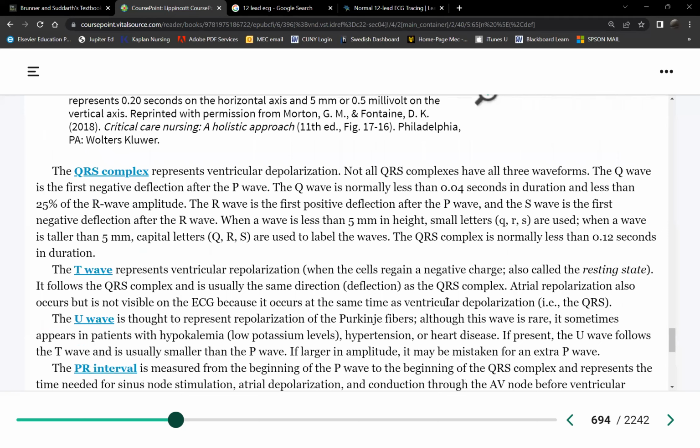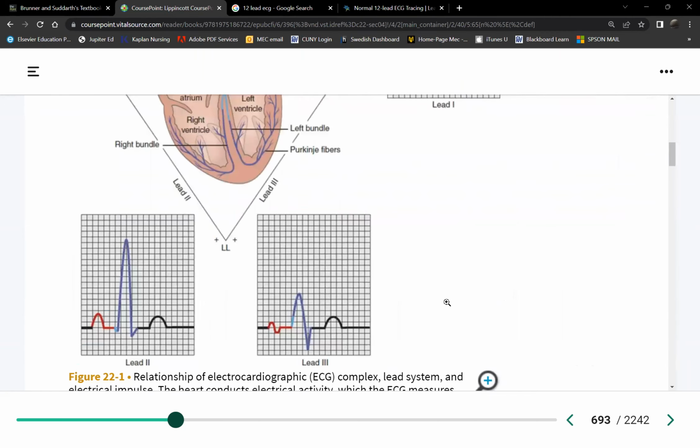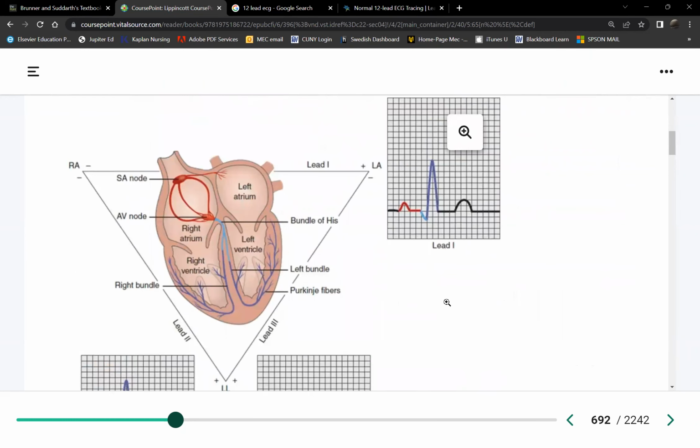Yes. Now imagine if there was no PR interval. Like I said earlier, does it take long for lightning to appear and strike something on the horizon? No, it did not take long at all. Not even 0.2 seconds, or 0.12 seconds. It happened really fast. So what is the role of the AV node, therefore? The role of the AV node is to transmit the impulse, right?